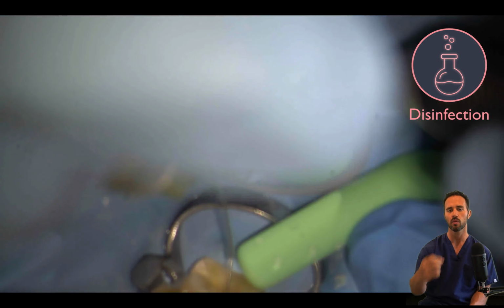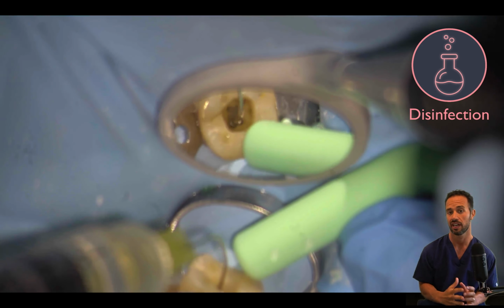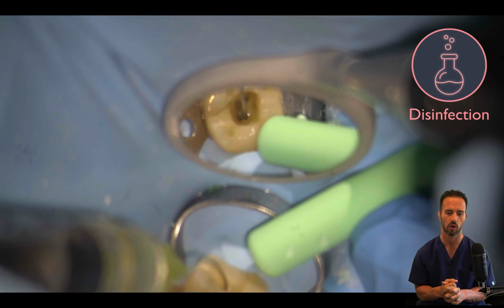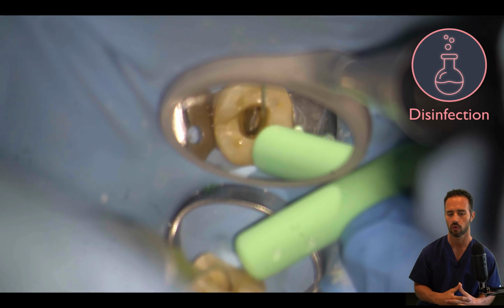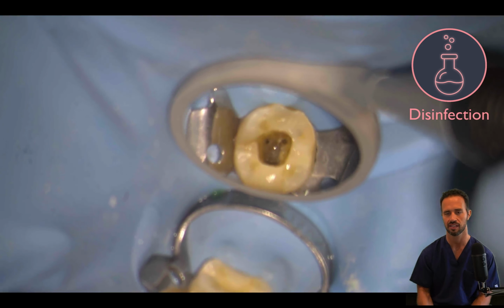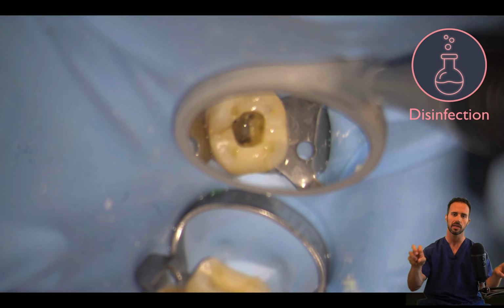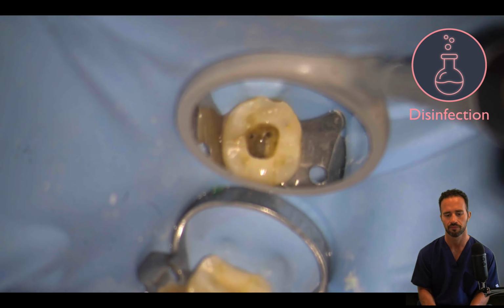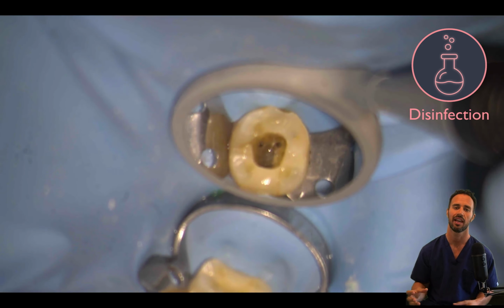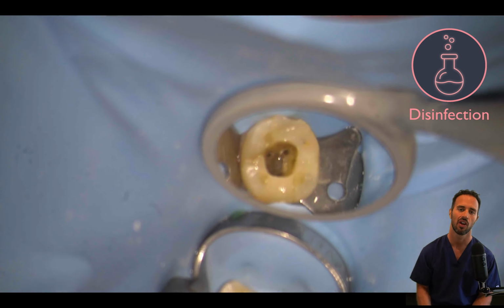And now we're proceeding with our 17% EDTA, as we always do, especially in a necrotic case. All right, so we placed it in all 4 of those canals, and we're going to actually let that soak for 60 seconds. This is a critical component in a necrotic case, especially a case with a lesion, okay, because we want to make sure that all that smear layer is removed internally, and that we're performing a maximum level of disinfection so that we can get the apical periodontitis to heal and have a happy patient with a tooth that's going to last her, hopefully, a lifetime.